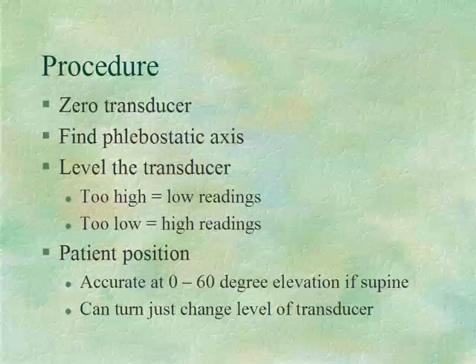Respiratory effort will change the readings, so you want to check at the end of expiration for accurate readings. And there's a figure on page 350 that shows you about that. PEEP, if they're on a ventilator, positive end expiratory pressure, if it's greater than 10 centimeters, will artificially elevate your occlusive pressure. So you need to check the trends then for that patient to find out what's appropriate for them.